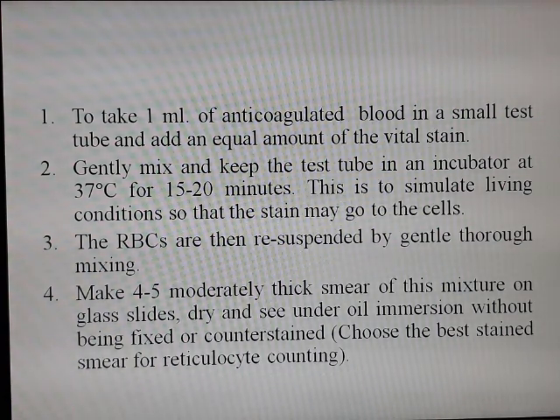It should have proper positions, it should be tongue shaped, and the other things as we know to be of an ideal blood film. After it is made, we will dry the smear and see under the oil immersion, and we will ideally choose the best stained smear for reticulocyte counting. Here we don't have to use any counterstain, we will just see it like that only.